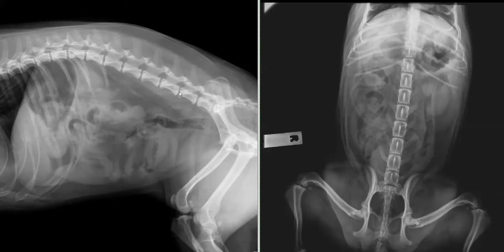The next thing I evaluate is the retroperitoneal space. It's vital that the radiograph is lateral in order to interpret this, and we can see the nice streaky fat and soft tissue opacities that make up a normal retroperitoneal space. It's harder to evaluate on the ventrodorsal projection.